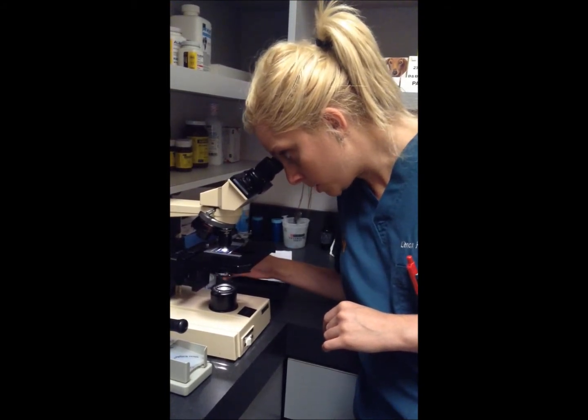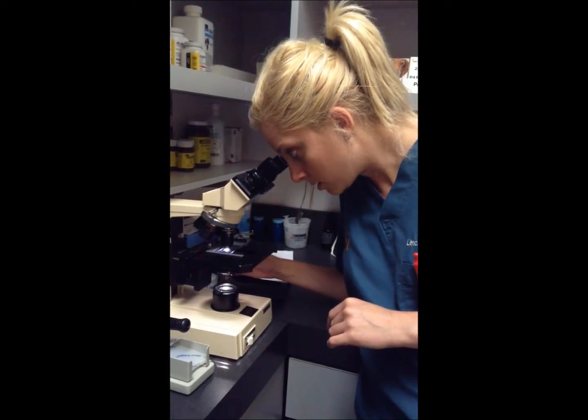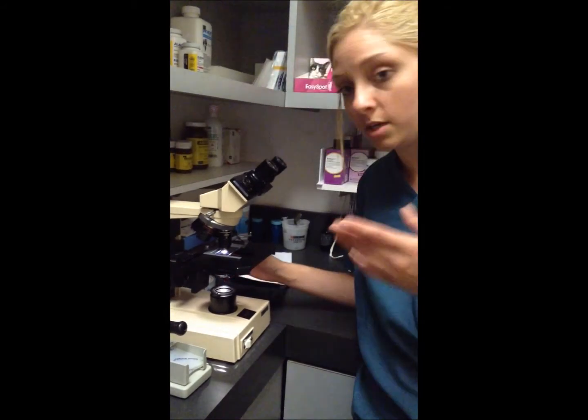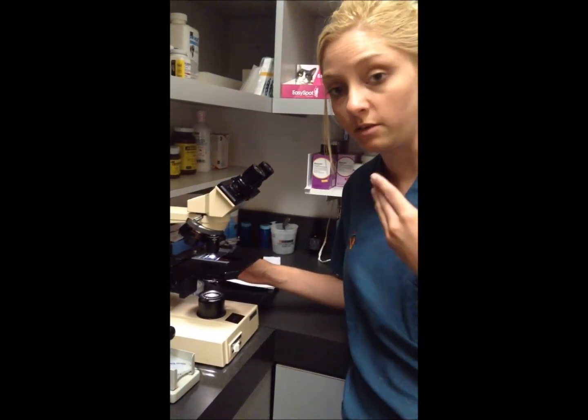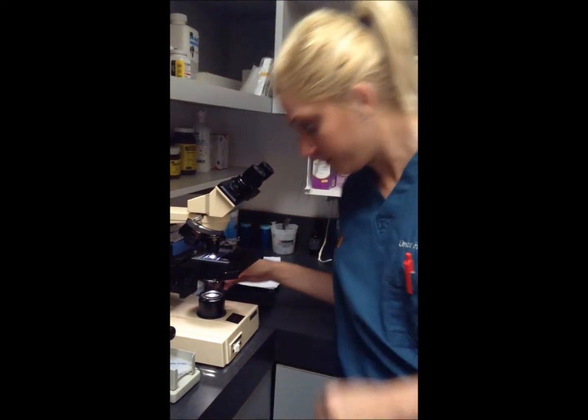And it looks like this patient in particular has a lot of yeast going on. Sometimes when they have a really bad yeast infection, you can actually smell it from their ear. And that's basically it.